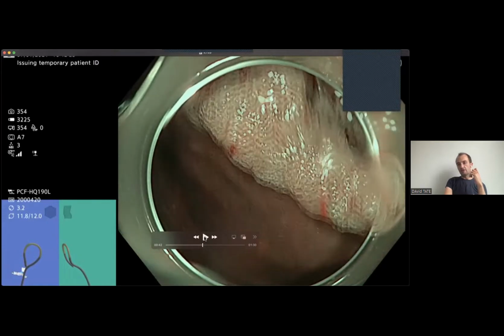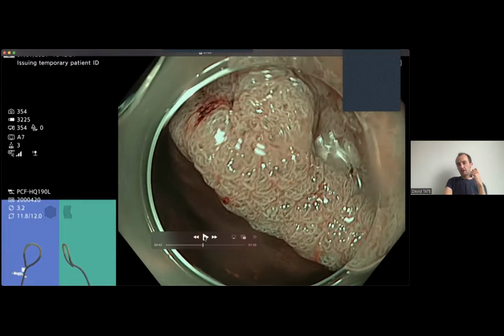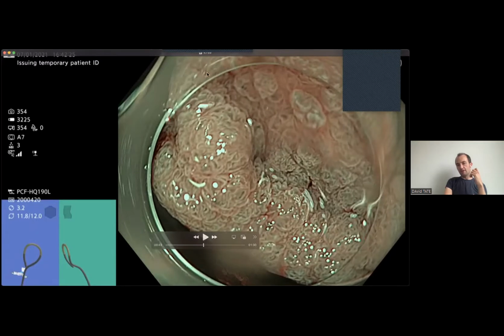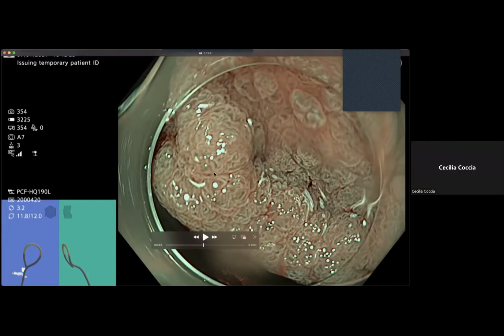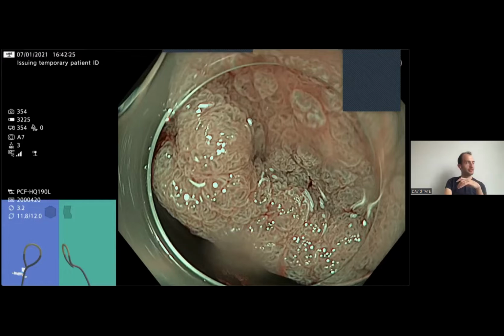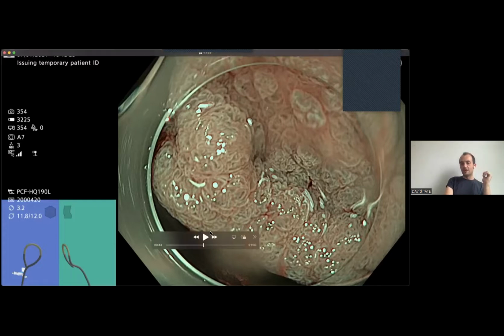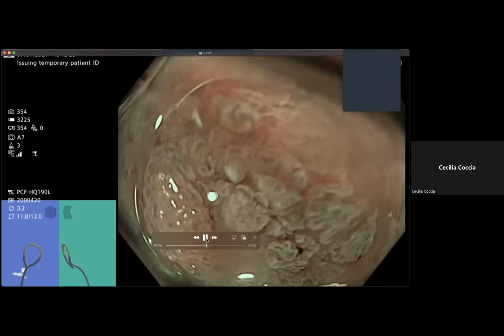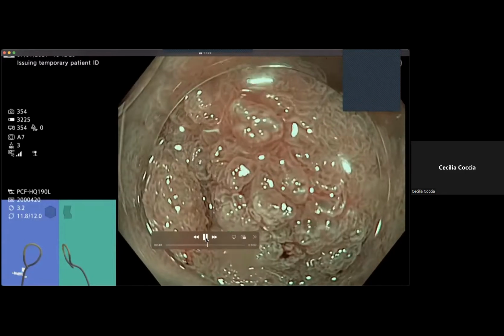The non-granular ones we showed before are all surface shiny, and these ones have little grains, like Rice Krispies. Do you have Rice Krispies in South Africa? The cereal. We definitely don't have it in Belgium, but we do have it in England. These look like little Rice Krispies in a bowl, the complete opposite to the flat, shiny looking one. So this is granular. And you already said the size, so we know it's in the size category.